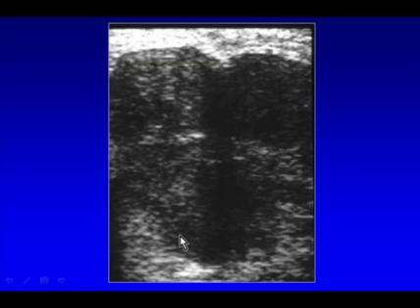I also want to point out, just in case I've not already made the point, that there was a lot of good through transmission through this metastatic lesion. Again, not helpful in these superficial tissues. Here's another metastatic lymph node from melanoma, a metastatic inguinal lymph node. Again, rounded rather than oval, very heterogeneous, no echogenic hilum. It had increased flow on color Doppler, not shown here, in sort of an irregular pattern.